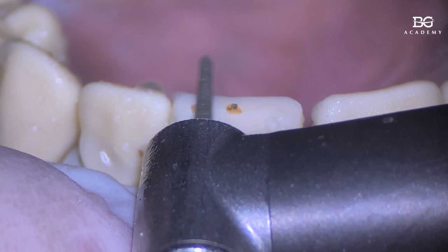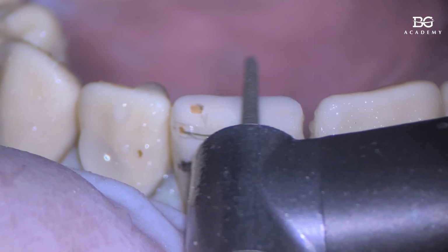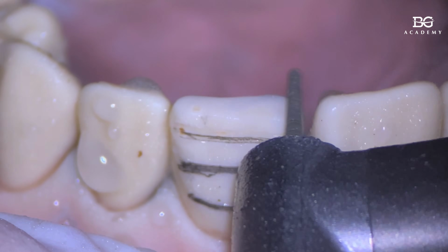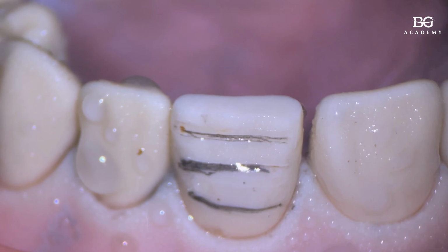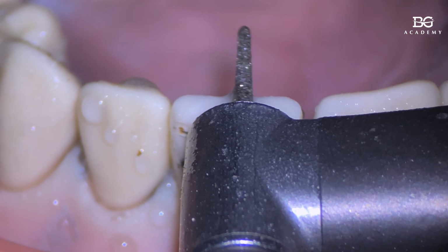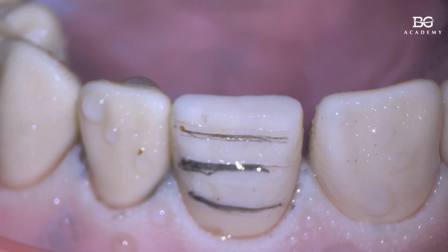When we do that, I use more buccal angle rather than palatal angle. So it's like 3, 5, 10 degrees buccally. The bur goes buccally, not lingually, buccally. It will be better for the insertion path later on.